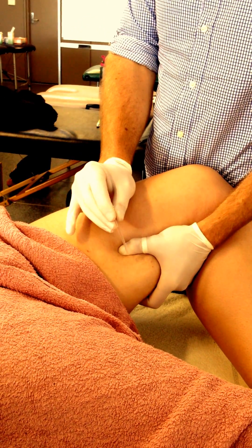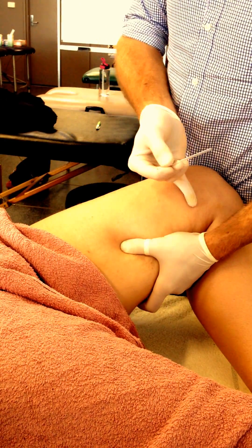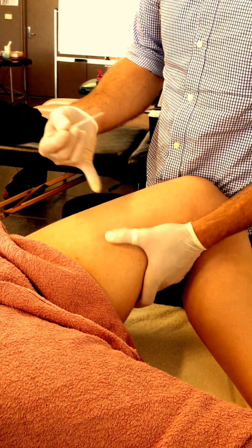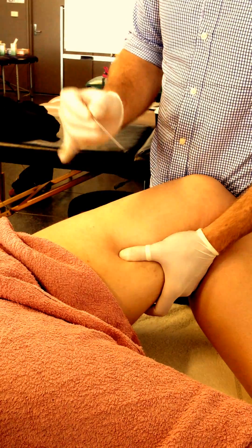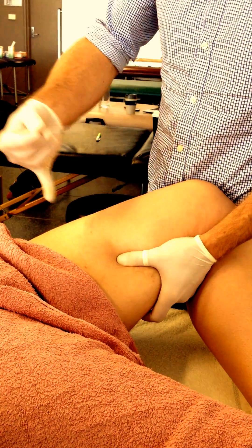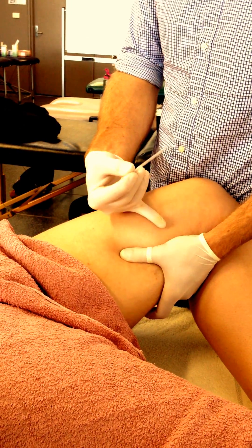So it means that we've got it pulled away and we're needling there. The other thing as well is, more distal, the femoral artery cuts through that adductor hiatus and then cuts posterior. So if we're able to pull away and then needle in that direction posteriorly, we're then directing that needle away from the femoral artery as well, if it has in fact coursed through that adductor hiatus already.